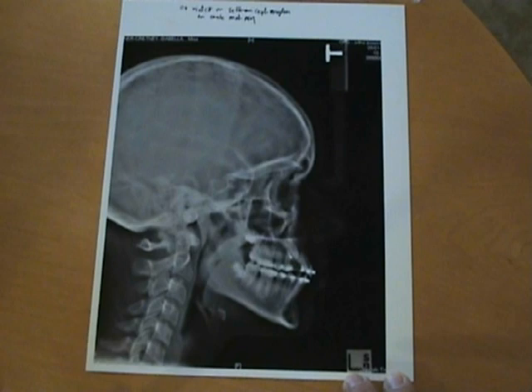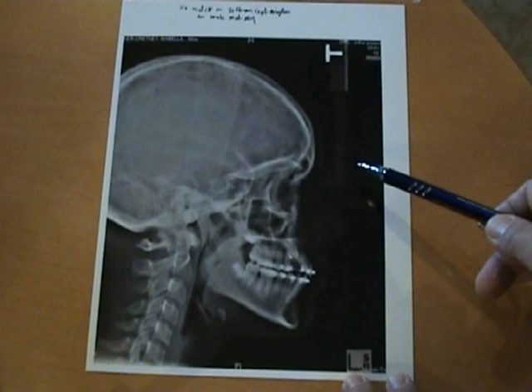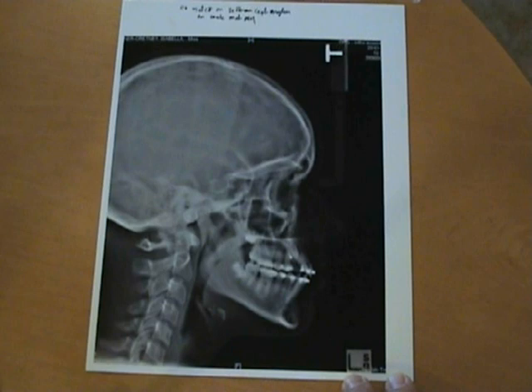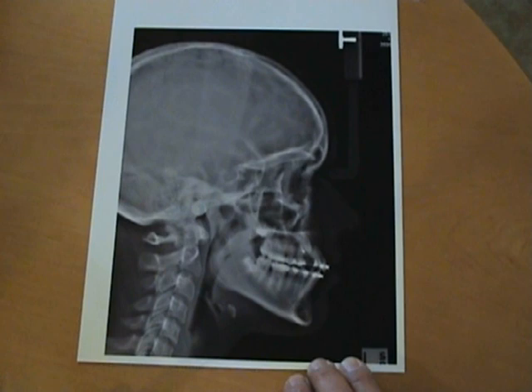Additionally, this is a digital radiograph, and I want each and every one to gauge and make sure that you have a one to one ratio. Some of these radiographs are not true one to one, and you have to make sure that they are one to one. If not, you need to have little gauges there to indicate whether it's 10% too big or 10% too small. You have to make sure that you are able to make the one to one ratio any way you can.